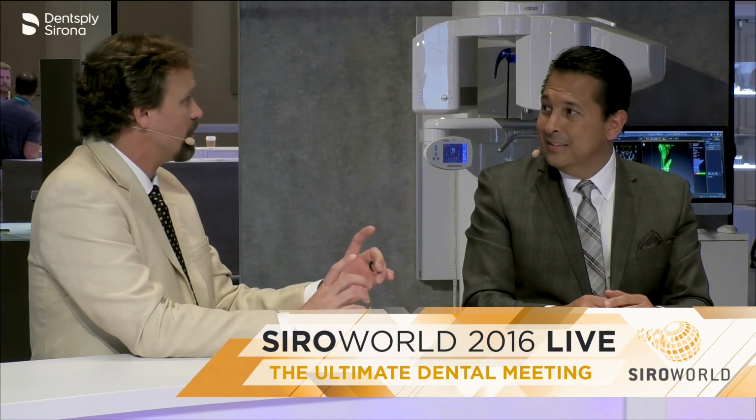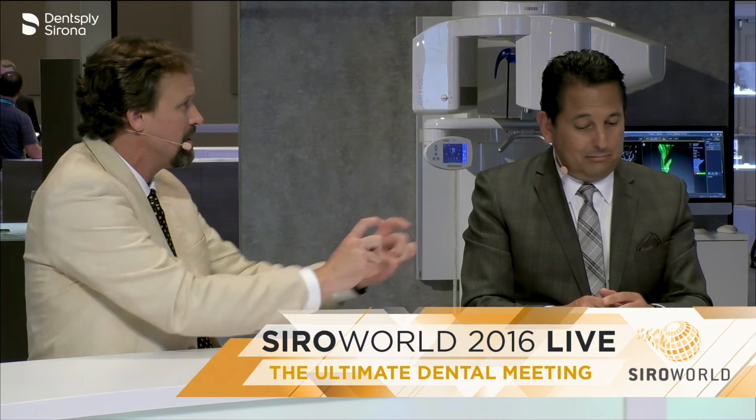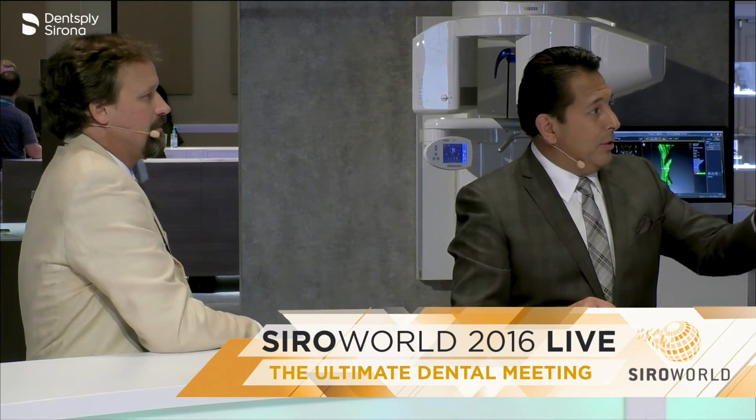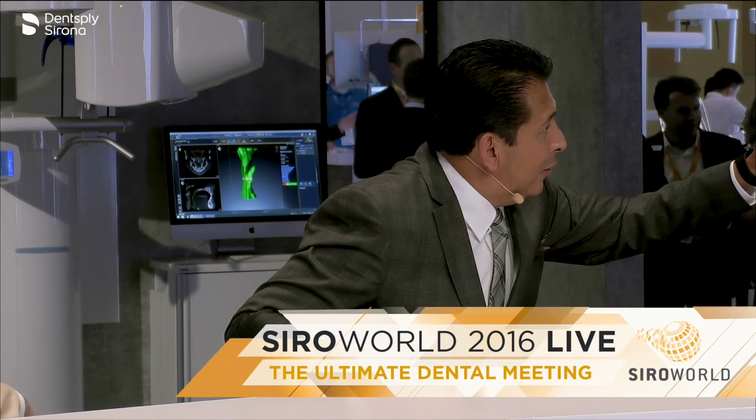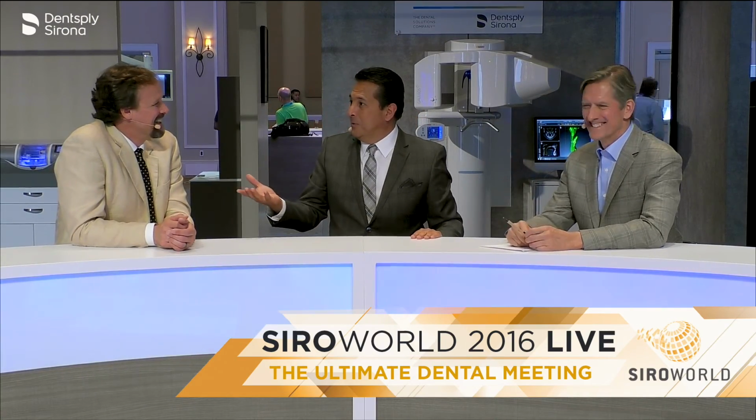In our world, what's so great about it is we already have the ceramics in our hands. We mill them out. We can try one in, try the other one in. They like it. That's it. This is the way we do it. Look very close to your line and go, this is the right one. Yes, that's right. The simplicity is so cool.